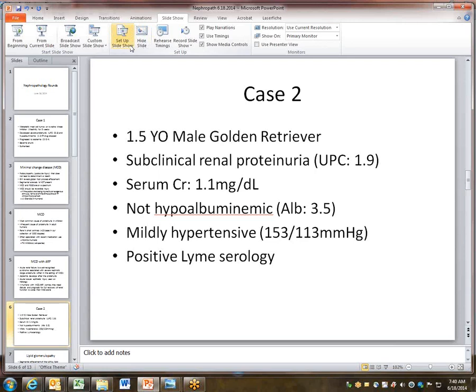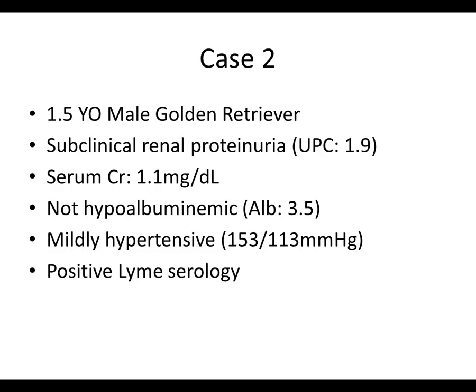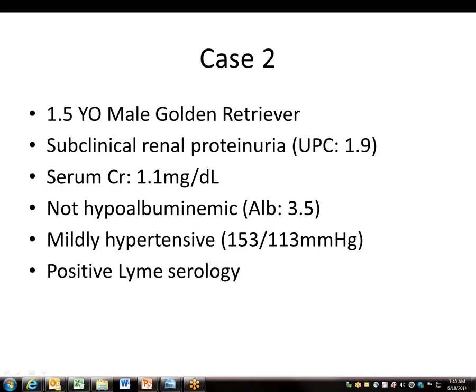I've had a previous question about what happens when you get a panel on boards that has 4 identical lesions all on special stains. I honestly haven't been on the board's exam committee, so I don't know how they deal with it. If I were going to do it to save time, I would say the H&E, PAS, trichrome, and JMS stain all show segmental effacement of a capillary loop by lipid-laden cells. And then I would say they are not PAS positive. You know what I mean? I wouldn't repeat myself over and over again for all the stains just to save time. I don't know if that's the way the board's committee would like it or not. That's how my reports have been with you guys when I've sent you the answers. I've basically said they all show the same thing, and this is what you specifically see on trichrome, and on the Jones you specifically see this. Okay, so that's an aside.